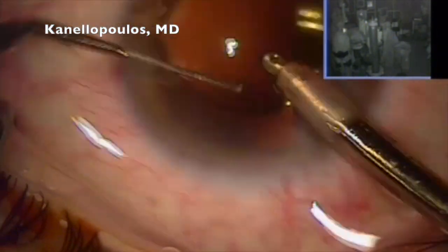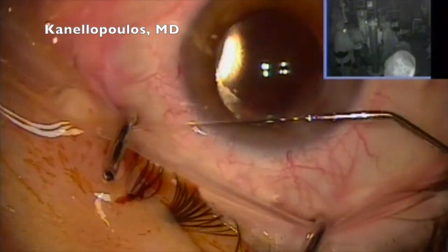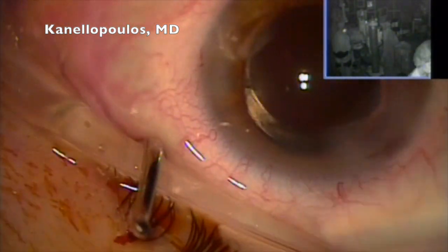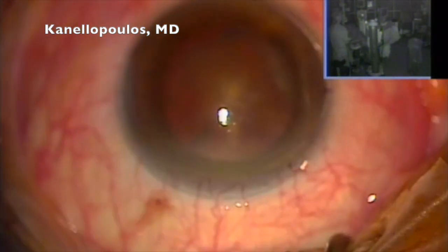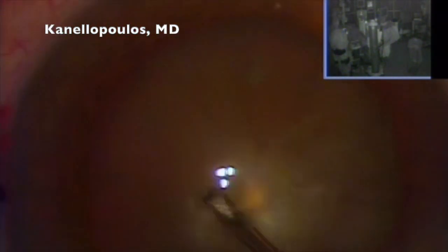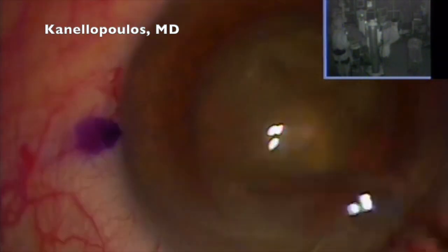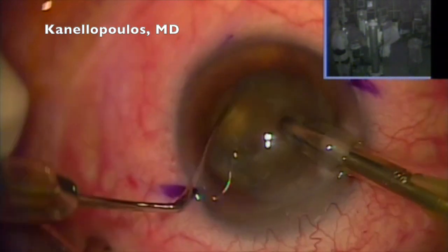Another very precise FACO IOL with toric lens — under, over — viscoelastic removal, hydrating the incisions. Key thing here: the compliance for the patient, watertight incision. T6 here — quite a bit of astigmatism — so I marked that patient myself. We can see he's a little bit older; he has a denser cataract. He also has against-the-rule astigmatism — it goes with age. Usually we're with-the-rule or oblique, but it looks like today everybody was against the rule. A little tougher to visualize the capsularexis here. And again, many thanks to Thomas Conan, a very esteemed colleague and friend from Munich, Germany.